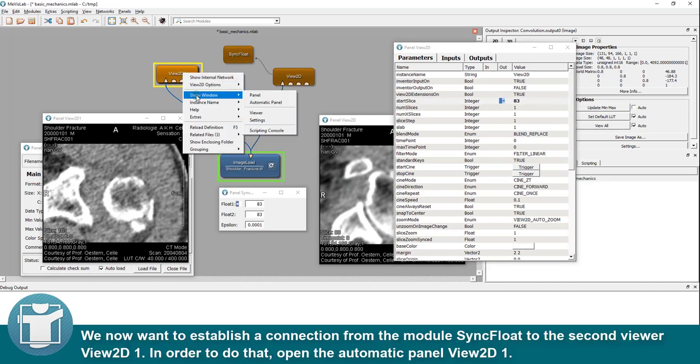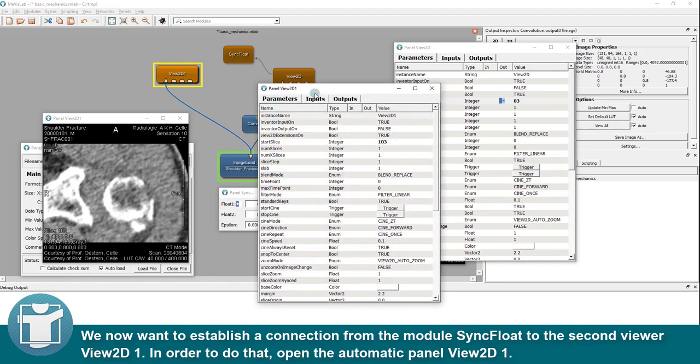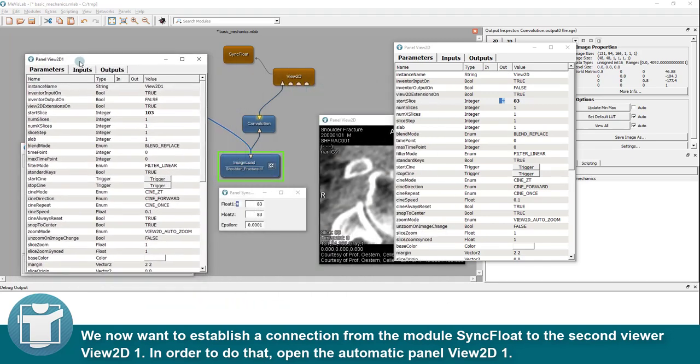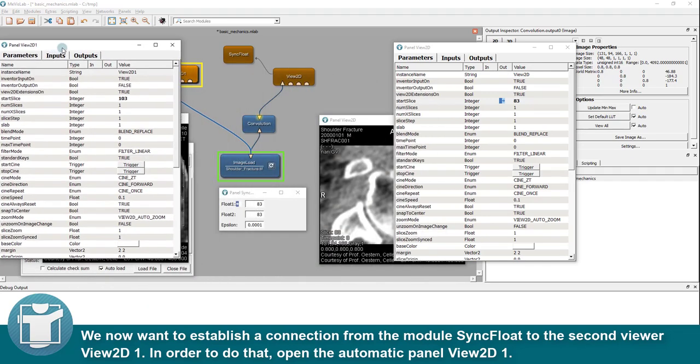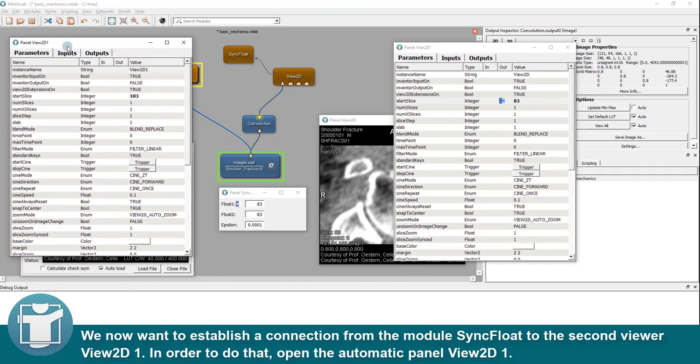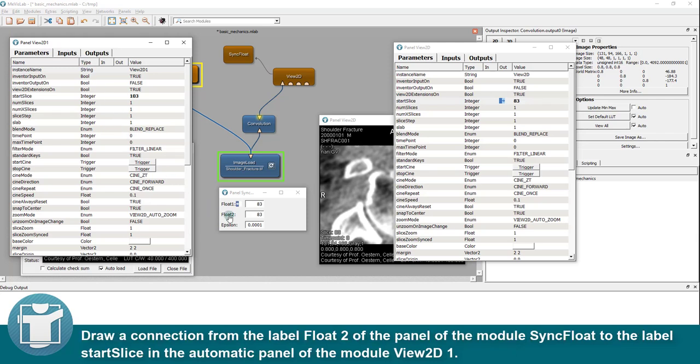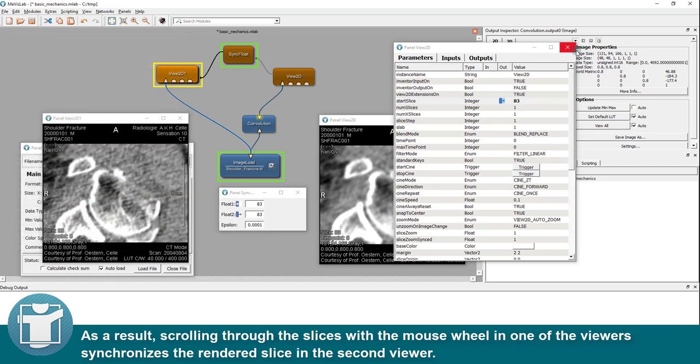We now want to establish a connection from the module sync float to the second viewer view 2D1. In order to do that, open the Automatic Panel view 2D1. Draw a connection from the label float 2 of the panel of the module sync float to the label start slice in the Automatic Panel of the module view 2D1.